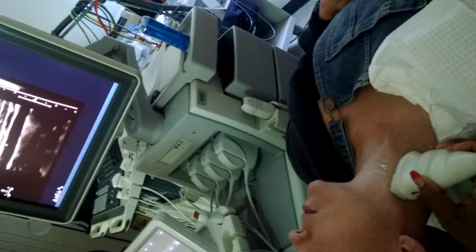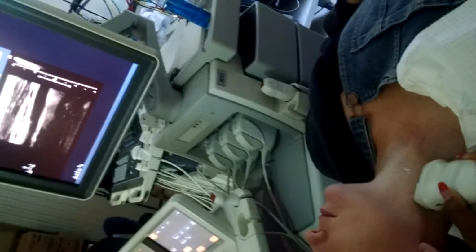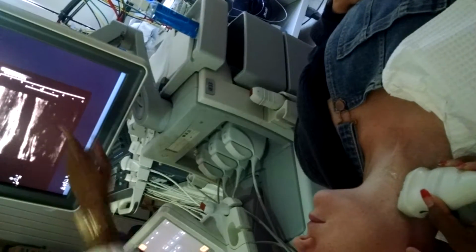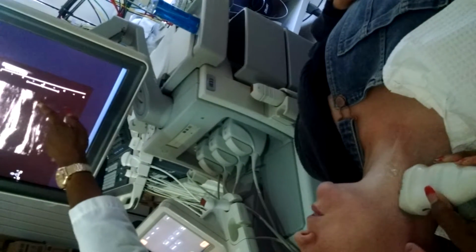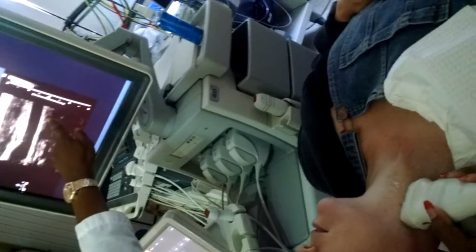So that's how you know you're proximal? Or how you can tell we're proximal? Yes. And then this is distal towards the bulb, and it starts to bulb out. You want to keep this open. See, I could easily start obliquing that. Right. That looks like a clot, thrombus or plaque. So you want to keep that open.